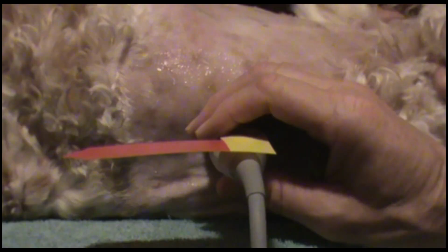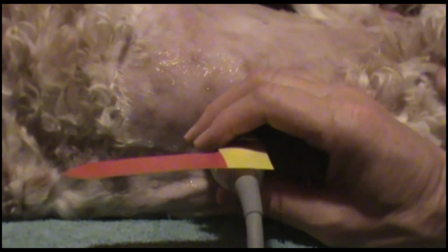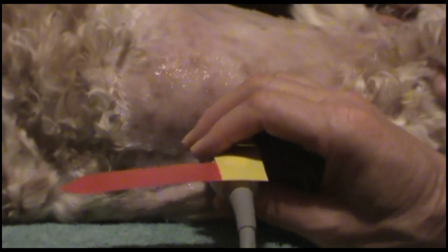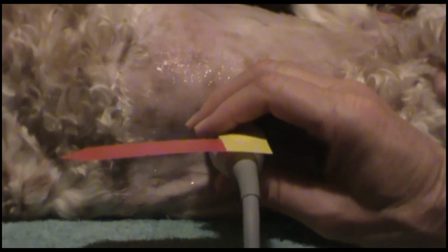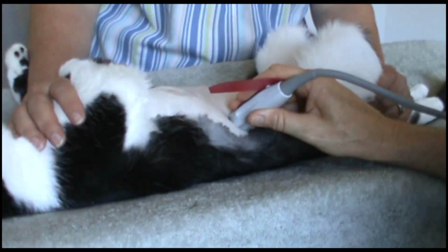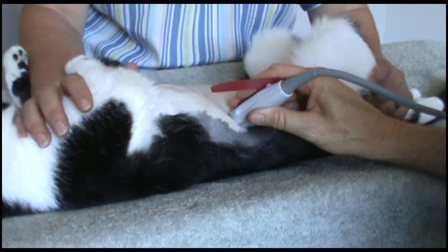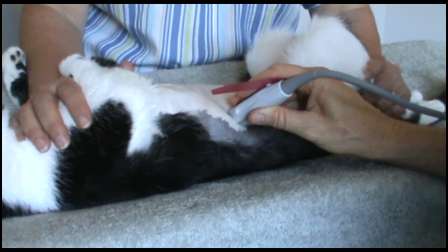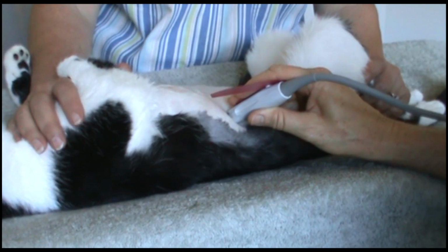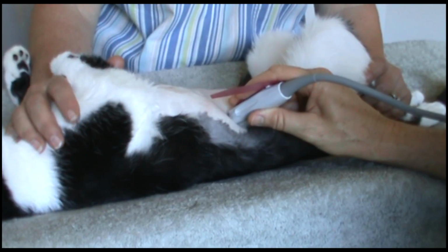The patient should be in dorsal recumbency. Sometimes it is necessary to tilt the patient slightly to its left to improve transducer positioning for the right lateral approaches. In cats, the right kidney and adrenal are usually caudal to the last rib. Remember, transducer pressure can push the kidney out of position and invalidate it as a landmark for finding the right adrenal.